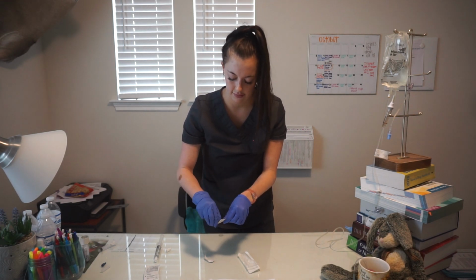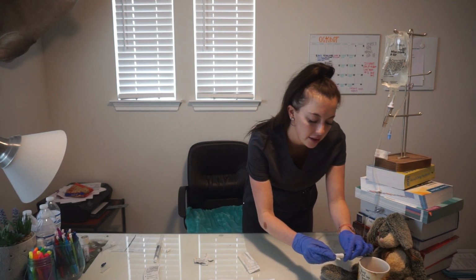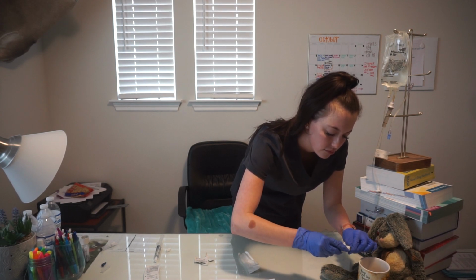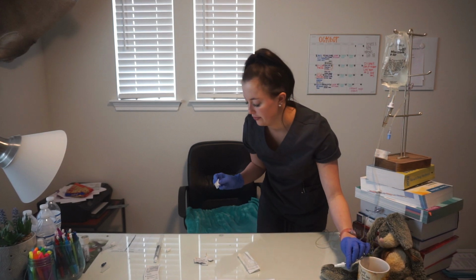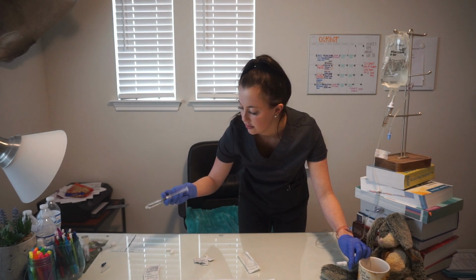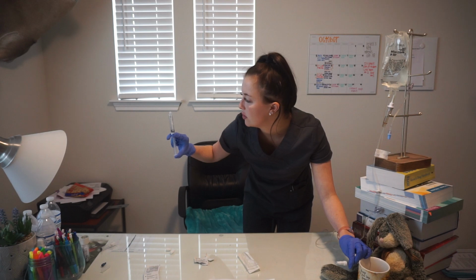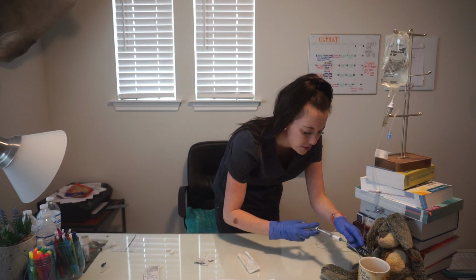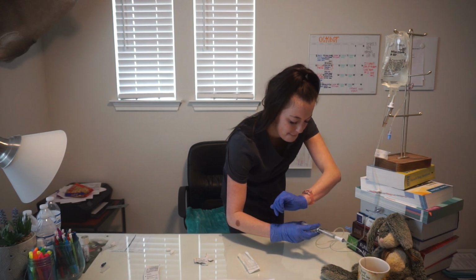Now, I'm going to flush one more time. Okay. Keep the air bubbles out. There we go. Going to flush the first 3 mLs for about a minute, just because there might be some leftover meds in there.